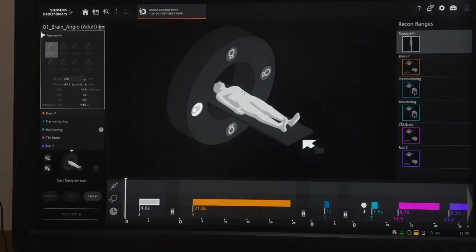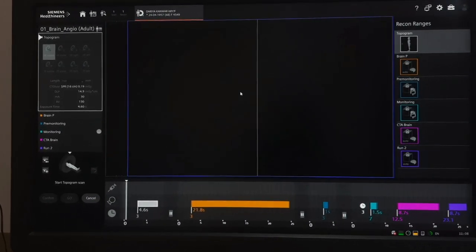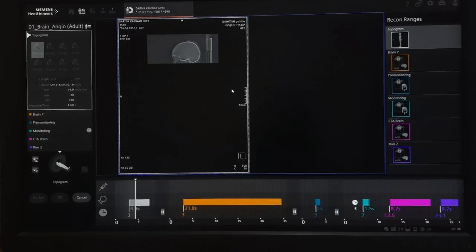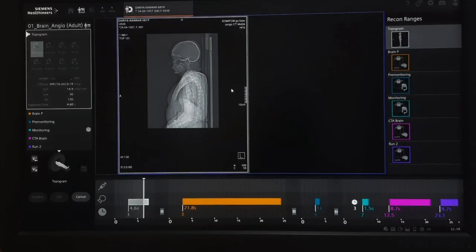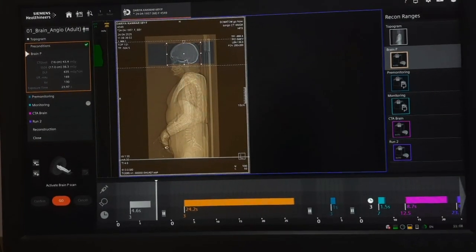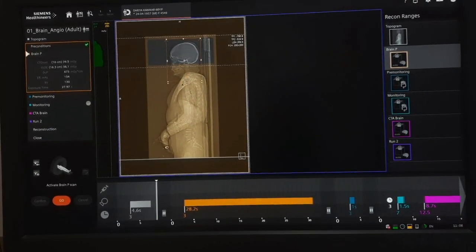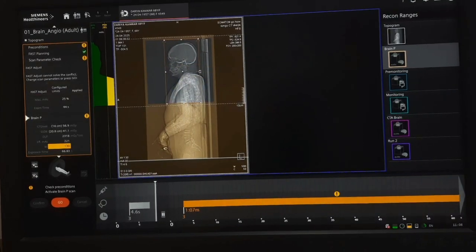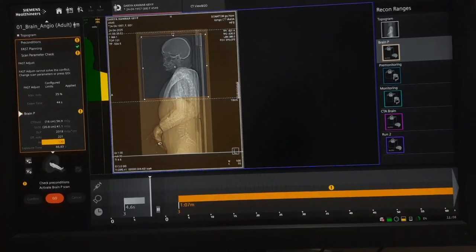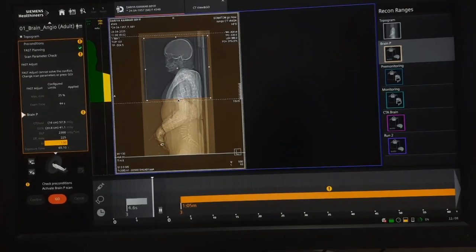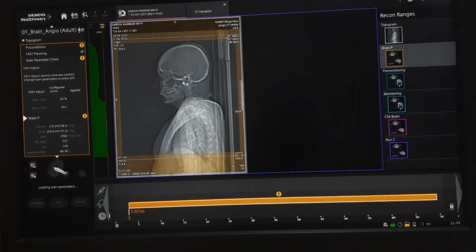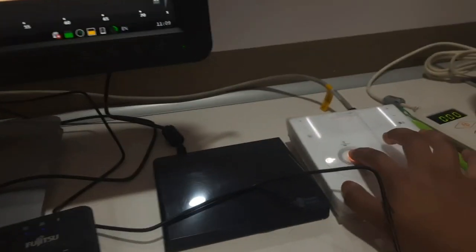Start with the topogram scan. Now cover the area: brain plus neck plus half thorax. Press go, then press start.